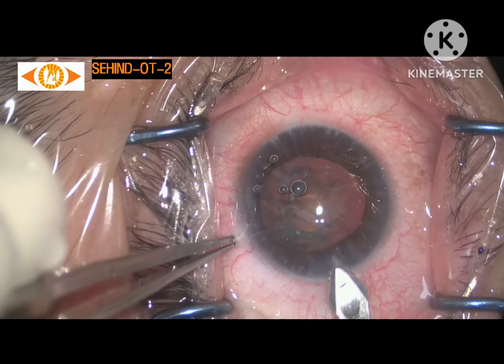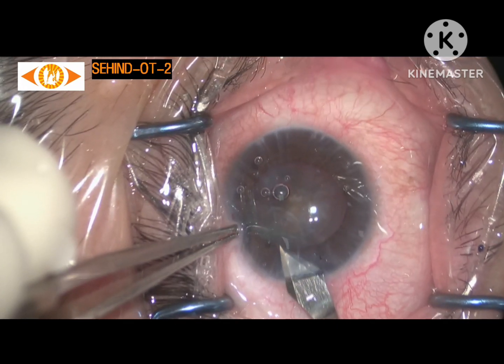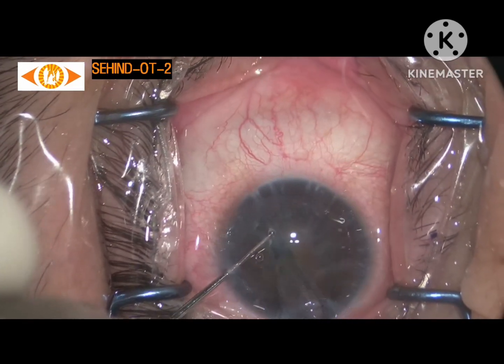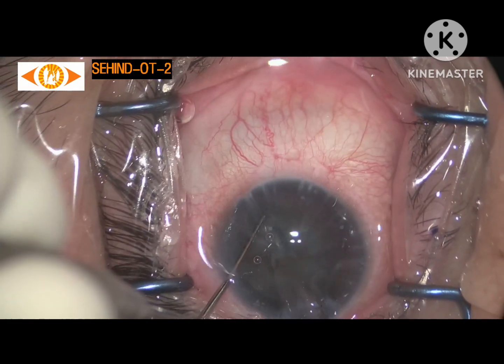Before moving ahead, we decided to extend our main port incision. We then began phacoemulsification with low vacuum and low flow rate settings.